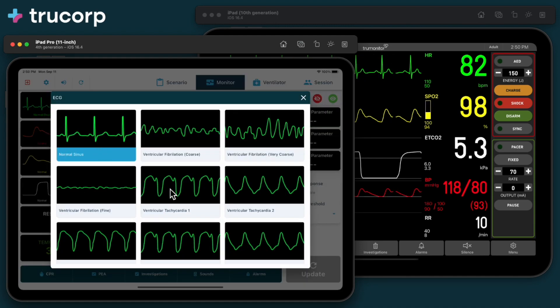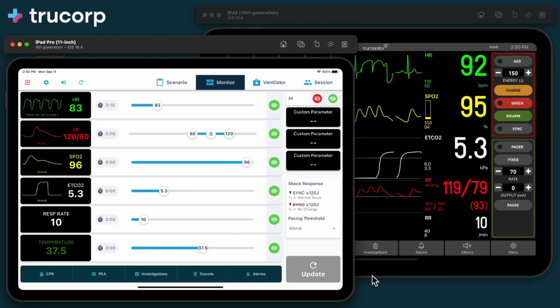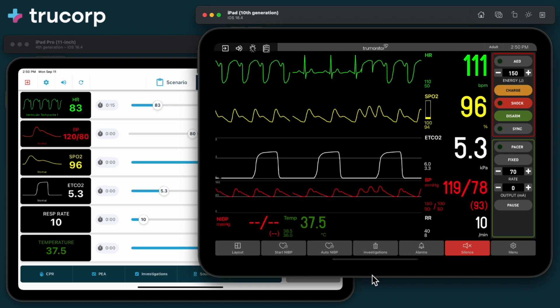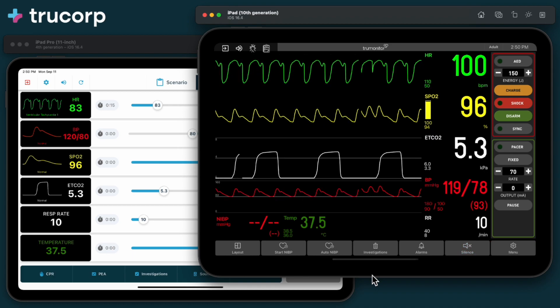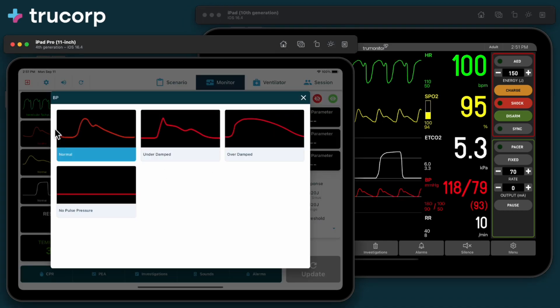Tap on a waveform to select a new pattern. Selected waveforms don't activate until you press the update button. You can select waveforms for ECG, blood pressure, SPO2, and CO2.